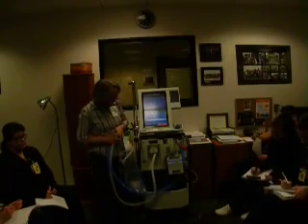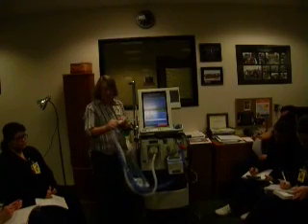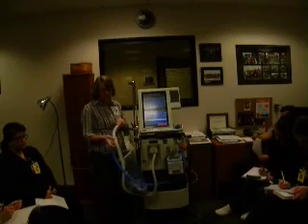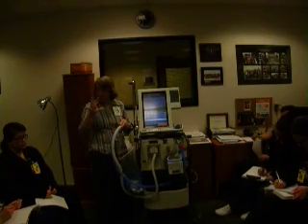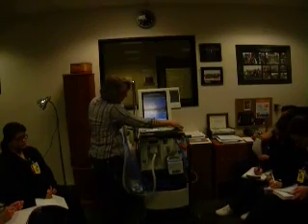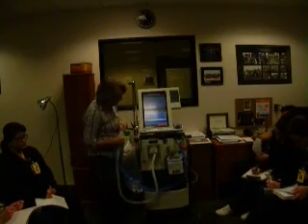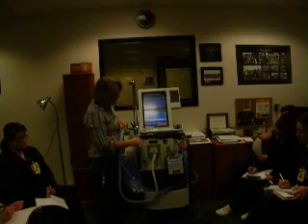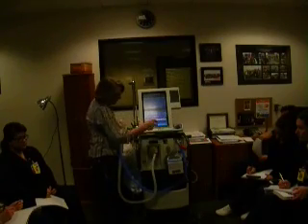Again. Now it's doing compliance. Compliance is testing for how compliant our circuit is. Does it let the air through easily or not? Some circuits, the plastic is more compliant than others. So that's what it's testing for on this one. Now it says block Y again, so I did, and I hit accept. There's water in humidifier. It says if yes, press accept. If no, press clear. So I'm going to press clear because we don't have any water.